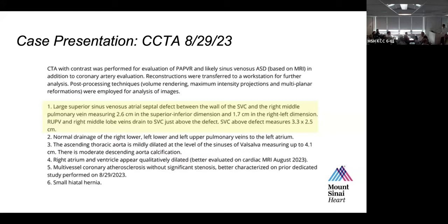Yeah. So, what Dr. Argowell said about the MRI is true about the echo. The echo sonographers are only as good as what they're requested to look for. And you put up that a bubble study wasn't done, but they're only going to do it if it's requested. If the request was RV function, that's what they're looking for. Dyspnea on exertion is LV function. They're going to do their job. So I think that's important. Had saline been done, it would have probably visualized in the left atrium from an upper arm injection.